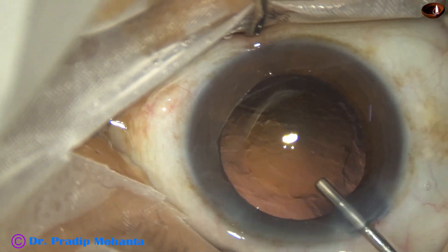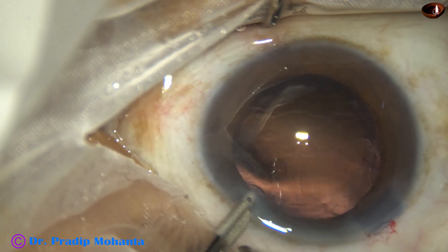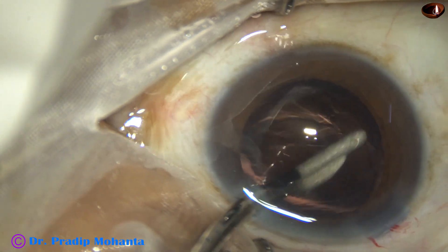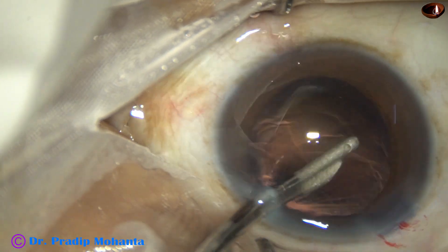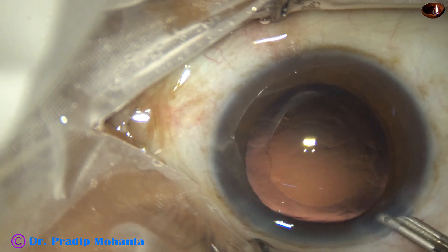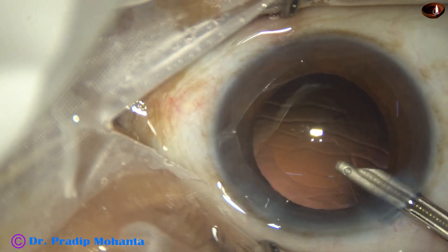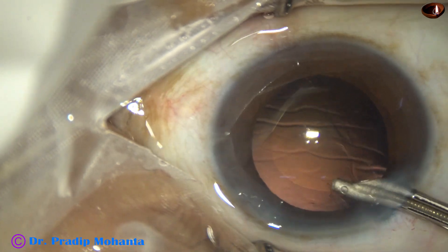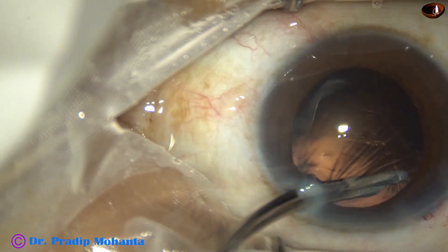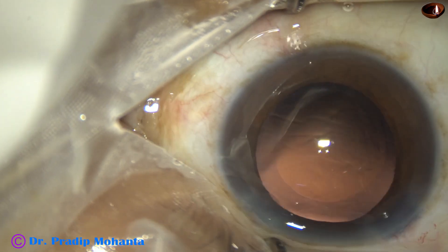I am injecting viscoelastic, taking the Simcoe cannula, and removing those lens fibers. Go through the main port and remove the cortex from five o'clock. Now this is the cortex from the sub-incisional area.